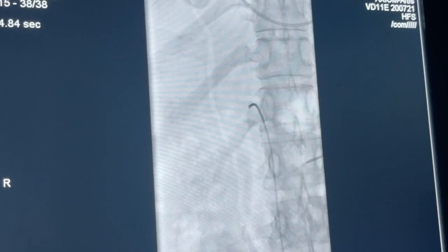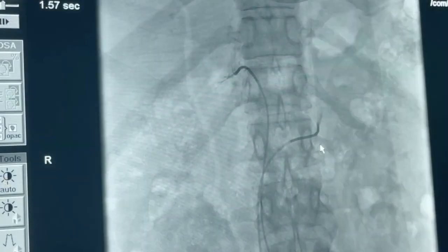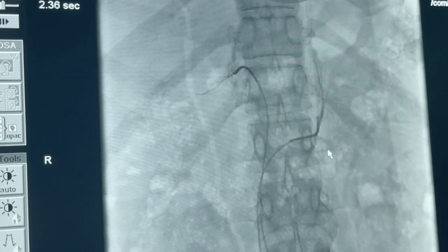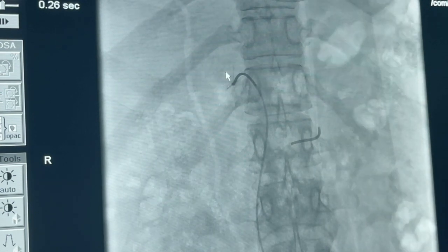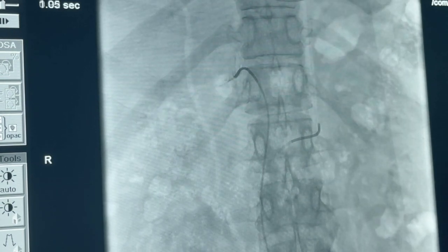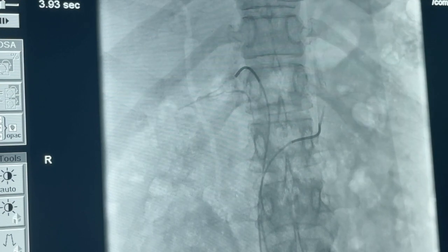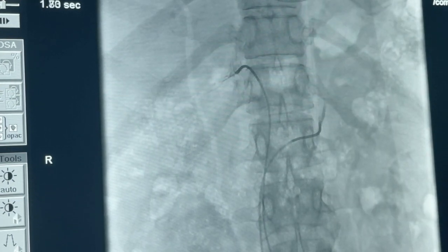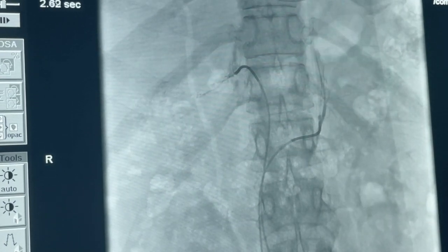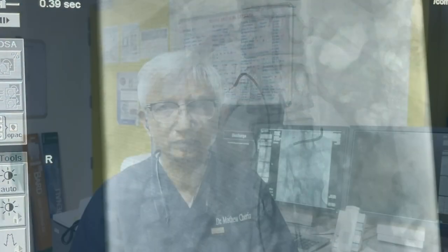Now he is ready to take the samples — make sure your catheters are not moved. The injection is made into the left adrenal vein, the right adrenal vein, and through the sheath for the systemic aldosterone level. This makes the procedure reasonably clear, and none of you should refuse a case because you don't know how to do it. If someone requests adrenal vein sampling, do not refuse — it is not a difficult procedure.